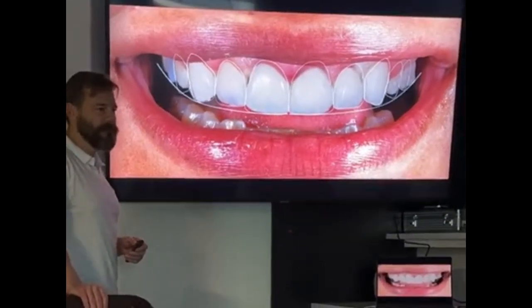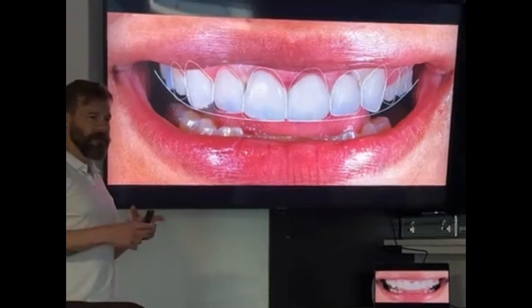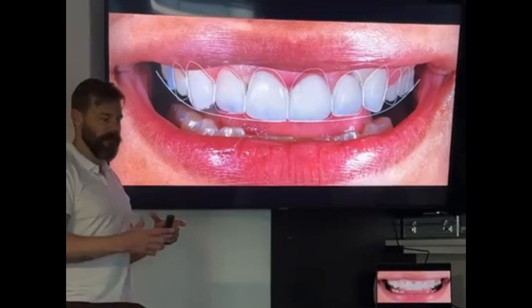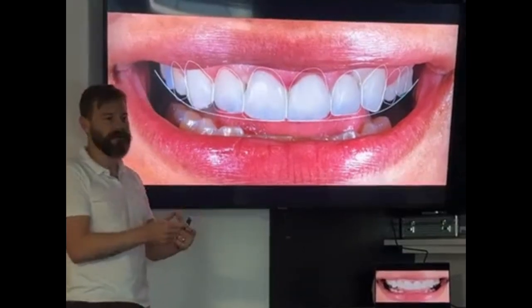And I pack, and the bone is there. So I'm going to tell you something. I do not use plugs so much because you cannot be precise the way you cut it, and you have the biomaterial, then you bring the abutment. Sometimes you push away, you give compression on the margin.